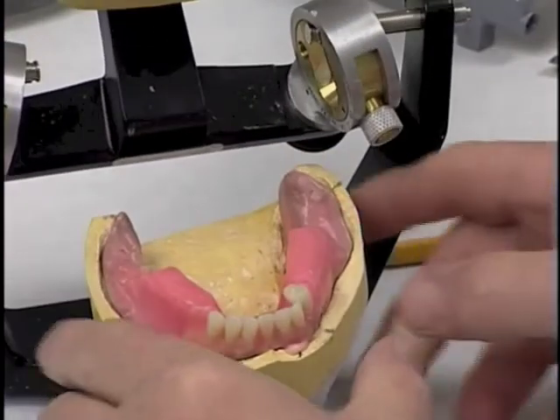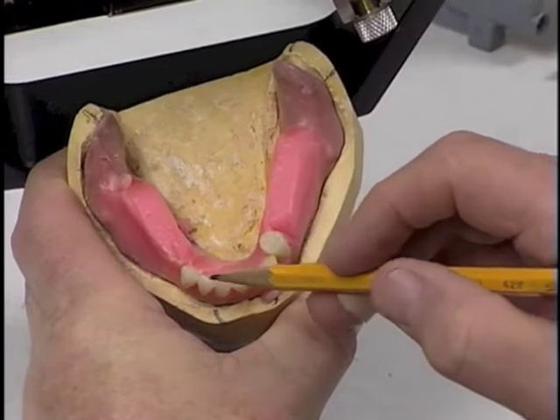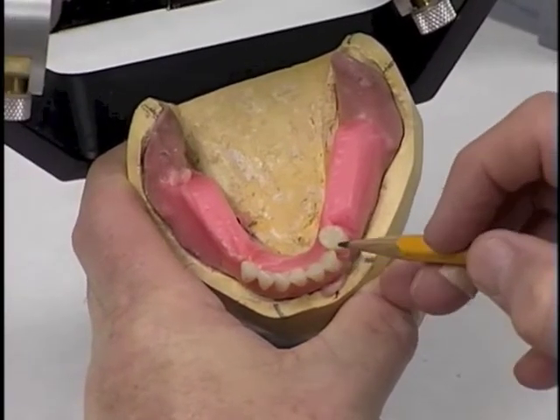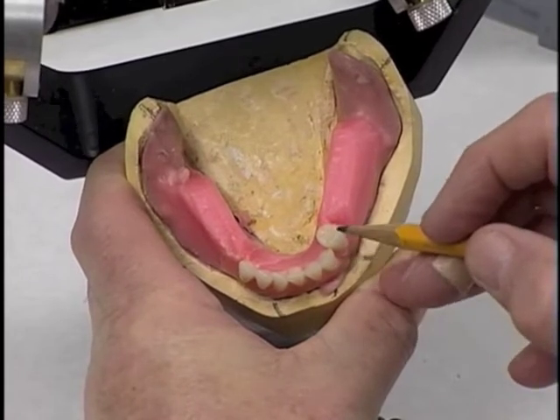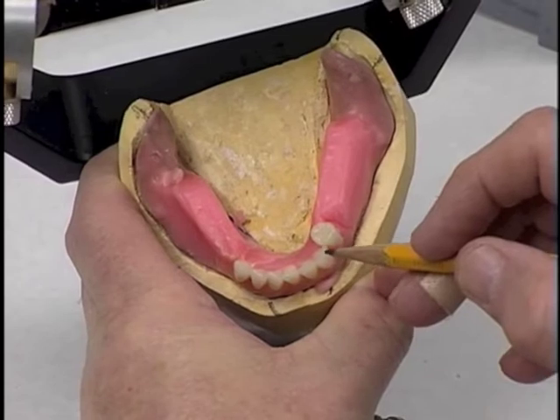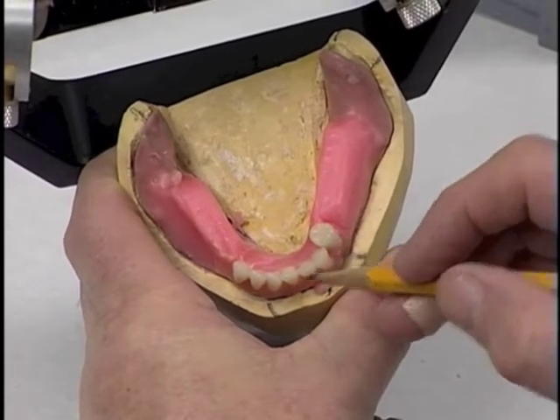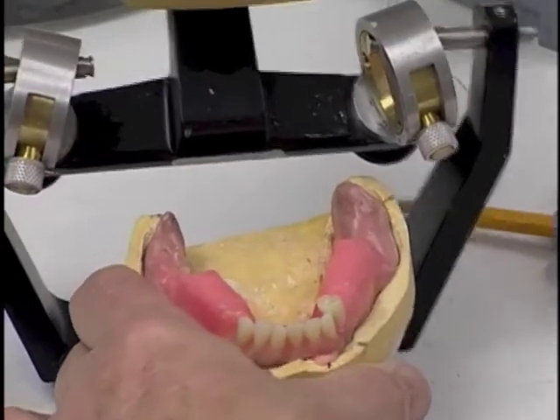And in addition, from an occlusal view, the arch form that we started with the anterior teeth should continue with the buccal cusp of the posterior teeth, and that's doing that quite well here. And starting out, it will be this buccal cusp coming right in, falling in alignment with the arch form that we started with the anterior teeth.